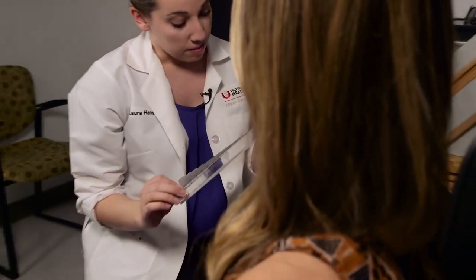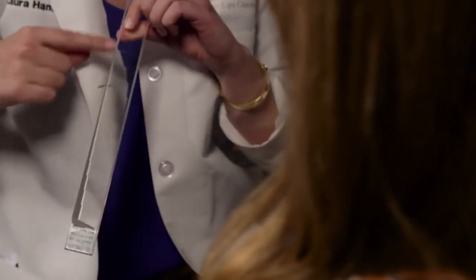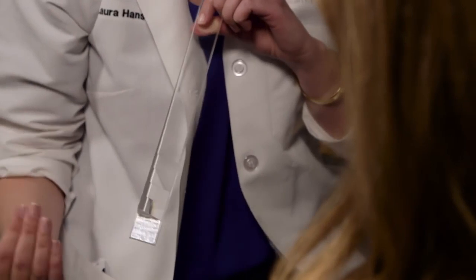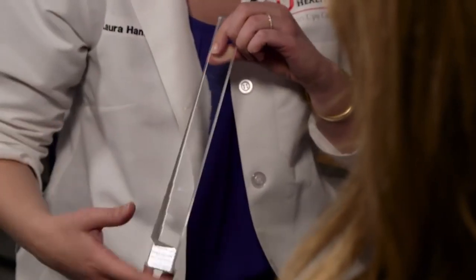This is a prism bar. This is one of the tools that we use in neuro-ophthalmology to measure deviations. Kind of makes it fast and quick. This is a horizontal prism bar. You can tell because the base is oriented out to the side. In a vertical prism bar, the base will be oriented on the bottom portion of each prism.